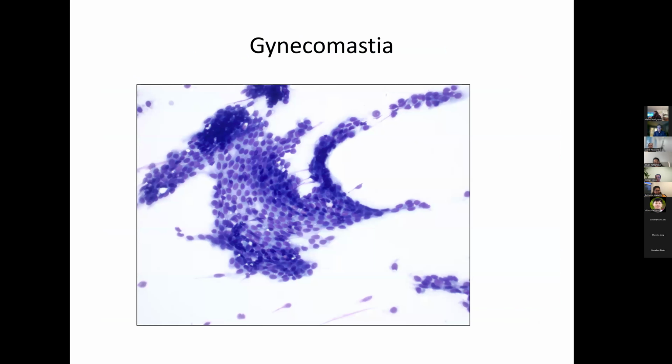So this is an entity in a male breast. It's similar in morphology. On cytology, it mimics a fibroepithelial lesion, and you can have these cohesive clusters. You have background bipolar cells. And you have a male patient coming in, and the history is also important, and clinical presentation is important. In fact, one of the clues they say is when you take the aspirate, it can be painful.